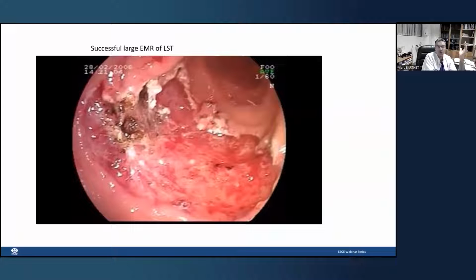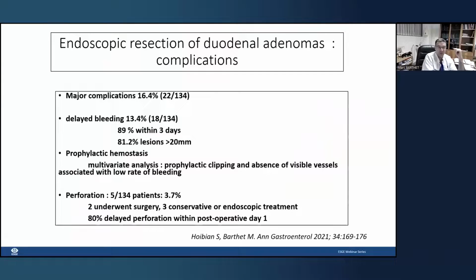And of course, with such a large resection, it's not possible to get defect closure. But if you have any bleeding or any visible vessels, you have to clip, because this is the most efficient way to prevent delayed bleeding.